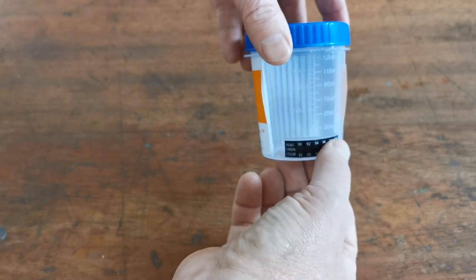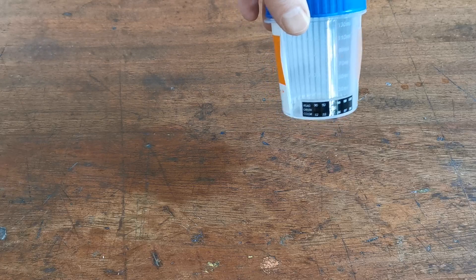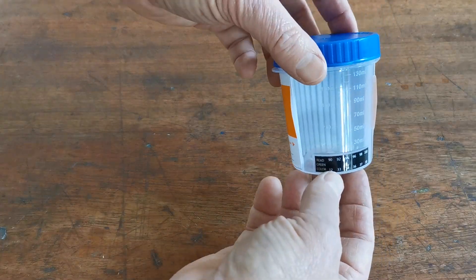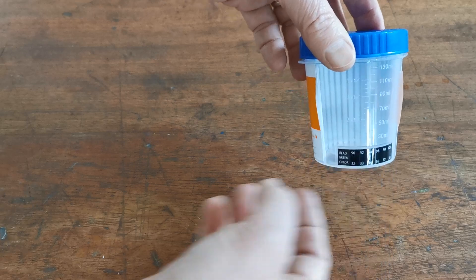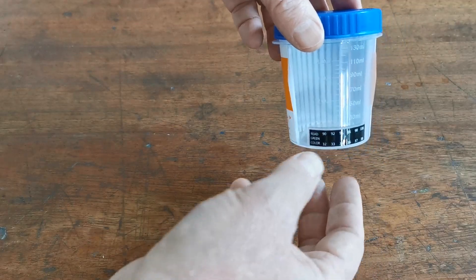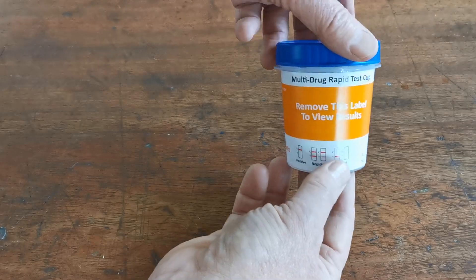The minimum urine level that you're asking the donor to provide a sample to is indicated with a little arrow on the side. And on the rear at the base, just below the minimum fill level, is this temperature strip. You're looking for a fresh urine sample to be voided into this cup, and the first check to make sure it's not been diluted, substituted, or had tap water added will be that it will show one of these colour ranges, indicating that it's at body temperature.